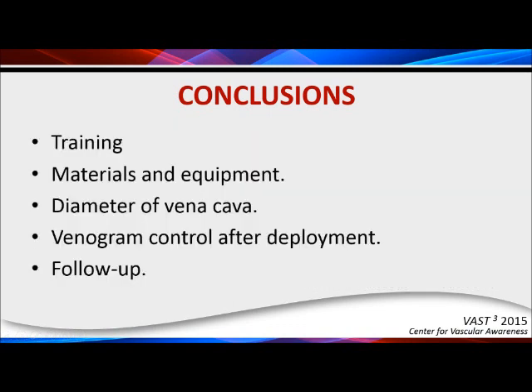So we need training to deploy Vena Cava filters, materials and equipment, always measurement of the diameter of the Vena Cava, venogram, control after deployment, and follow-up.